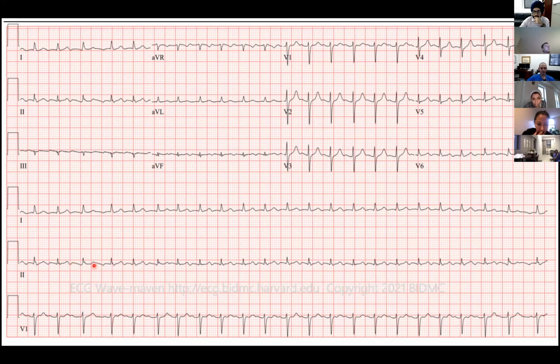So this would essentially be your atrial flutter, right? As the circuit goes, it kind of slows down a little bit in the isthmus portion, and then depolarizes, and then again slows down, depolarizes. It's a really good thinking process. That's your in-between, right? You're not in atrial tachycardia where you have a nice, anatomically nice P wave, but you're also not having atrial fibrillation where everything is just disordered. P waves are also a little bit more discernible in V1, a little bit more than V2.